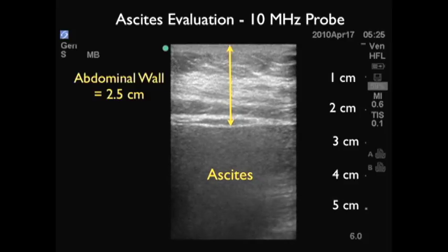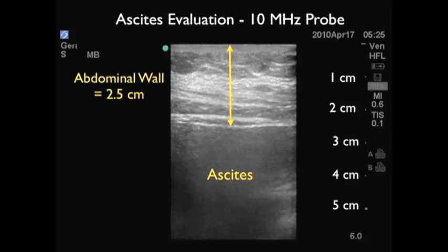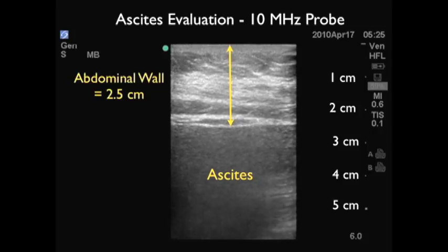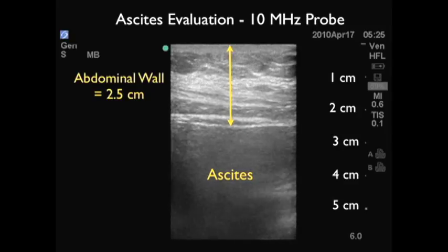So this is actually the position in which we perform the paracentesis using a longer lumbar puncture needle, and we're safely able to get a paracentesis done and get the ascites fluid out for evaluation in the lab.